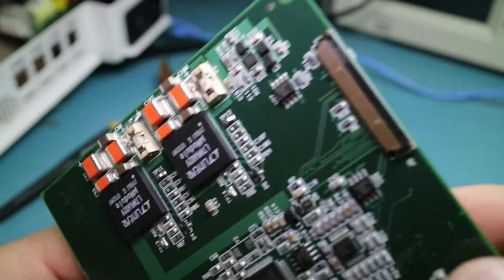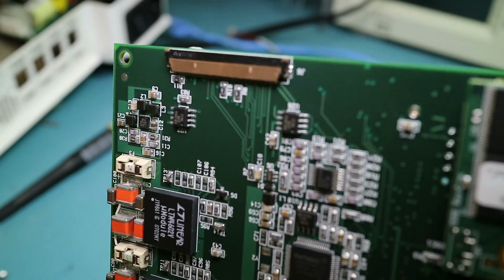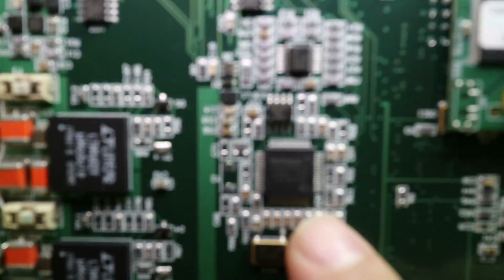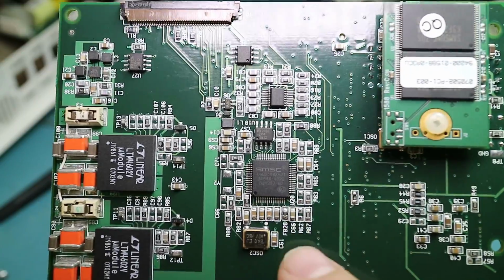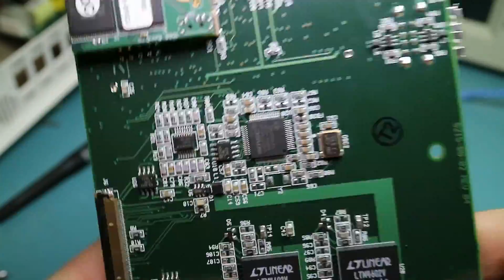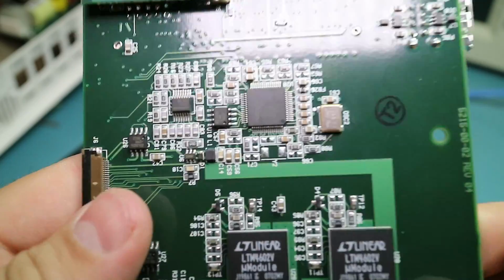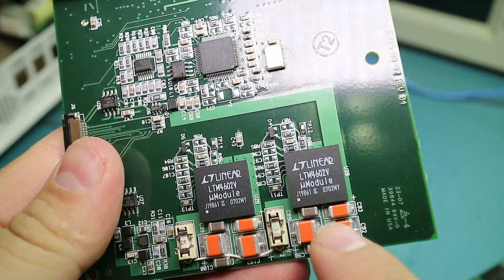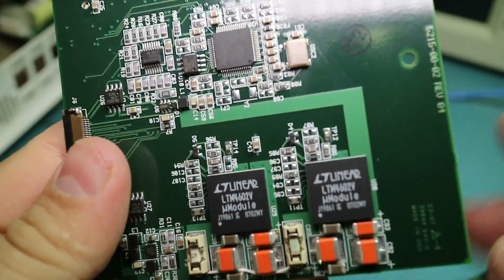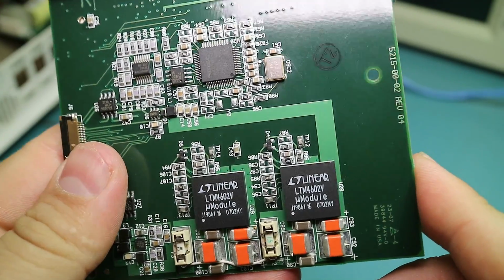And on the back we've got simply an SMSC controller, which is probably a USB hub or maybe a microcontroller running everything. Some nice linear DC to DC converters with rather large capacitors and some nice fuses.